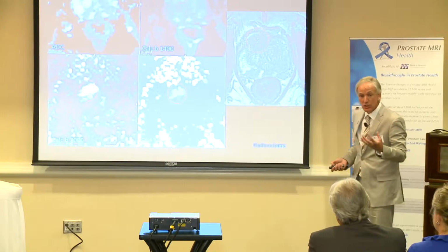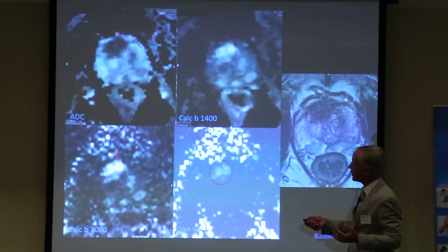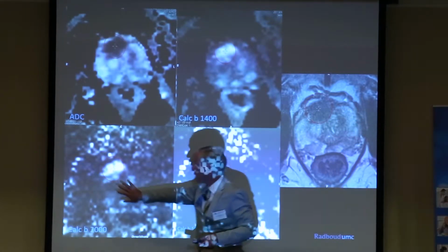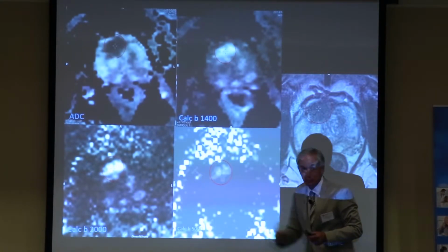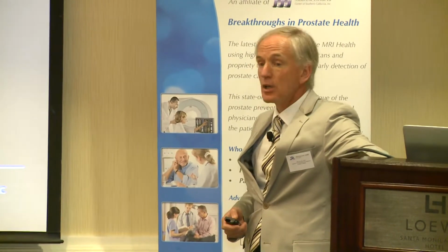Now, another thing, this is for radiologists only: I would like to stimulate you to use high B values, which you can calculate. This is a tumor, and you see the higher you go, the brighter this is. Nobody, even at the last row, will miss this tumor. This is cancer. And you can even reduce all of the prostate and have only the tumor visible. Something new. So we can enhance our diagnosis.